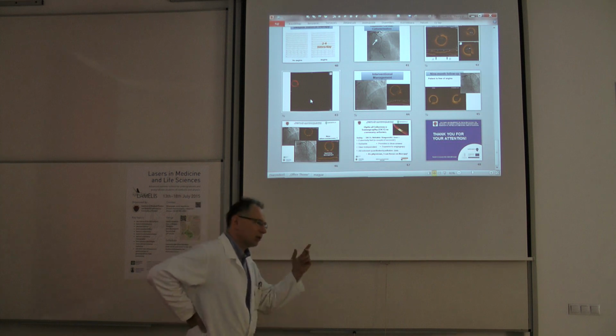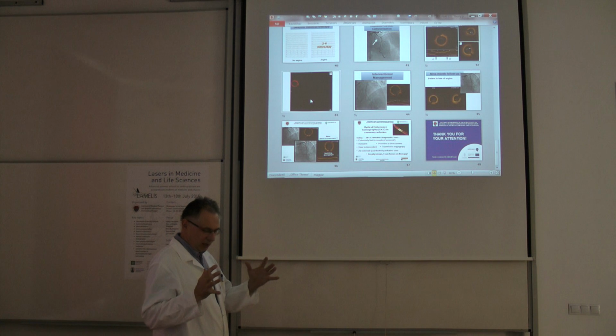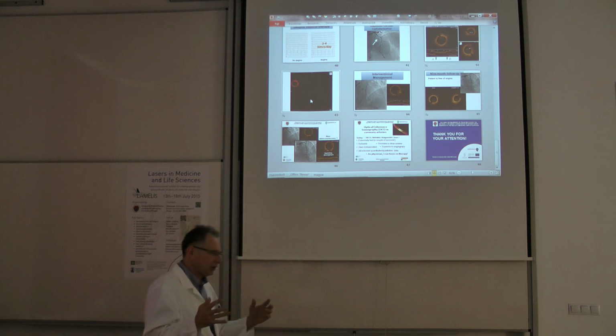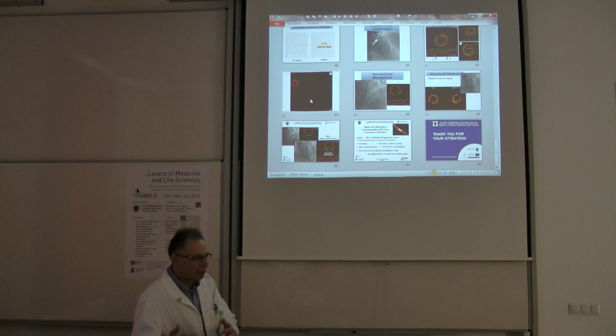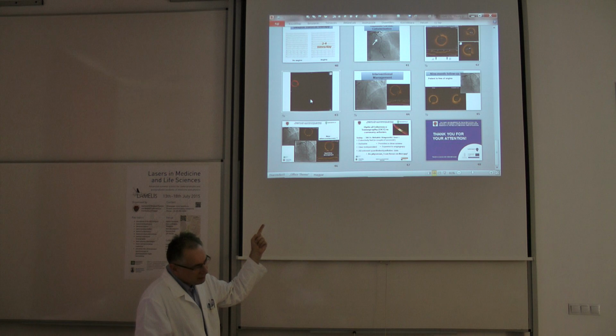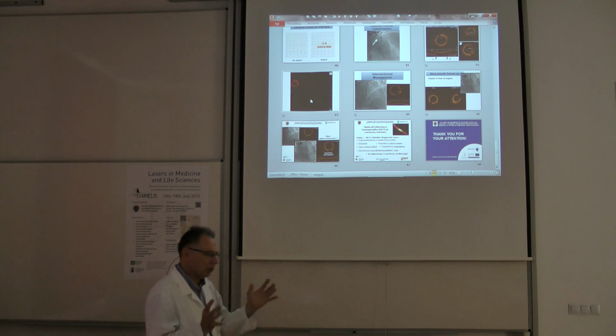Because of this, the OCT is so full of information. It shows you this section after stenting. It's a large metallic stent which at the edges dissects the coronary artery wall. For establishing that there is no possibly dangerous dissection at the end of the procedure, if you don't do the OCT, we would need extra projections, so maybe an extra 30 milliliters of contrast agent. They try to prove, as the very last image, as a control, that your acute post-procedure result is very good.